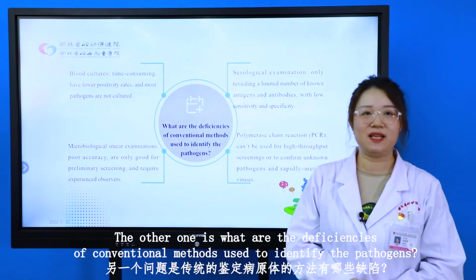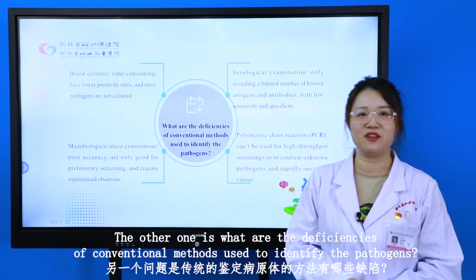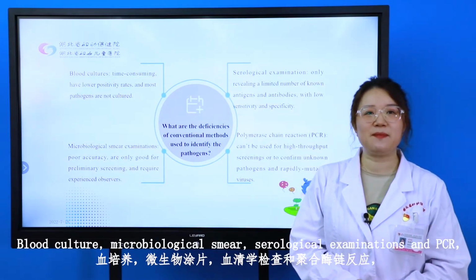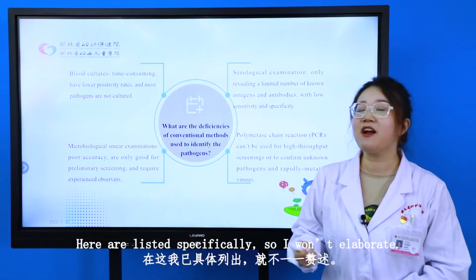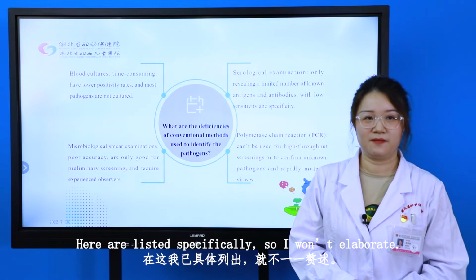The other one is, what are the deficiencies of conventional methods used to identify the pathogens? Blood cultures, microbiological smear, serological examinations, and PCR. The methods mentioned above usually bring us some confusions and challenges that can't be ignored. They are listed specifically here, so I will not elaborate.